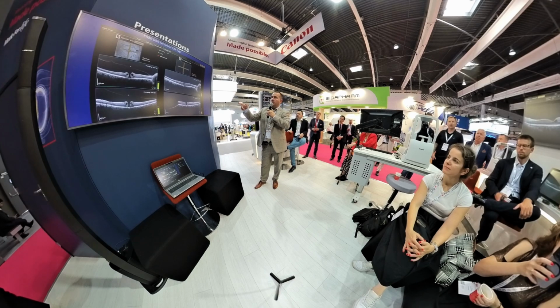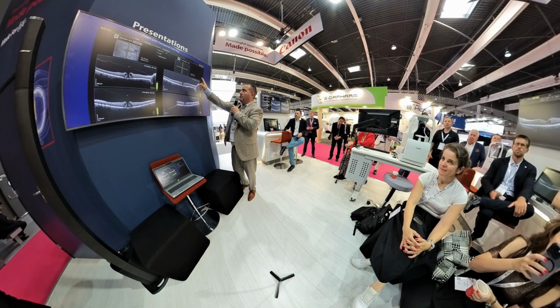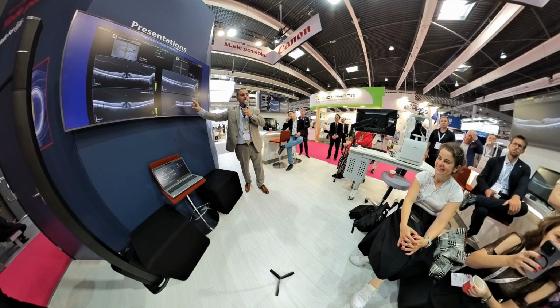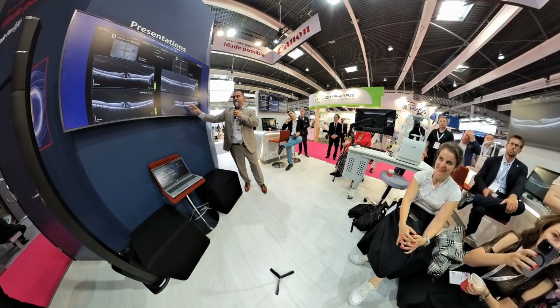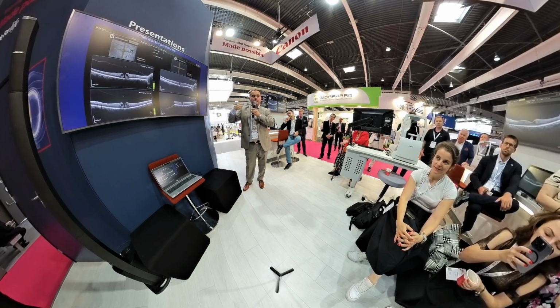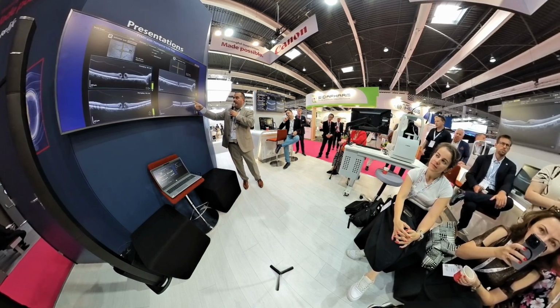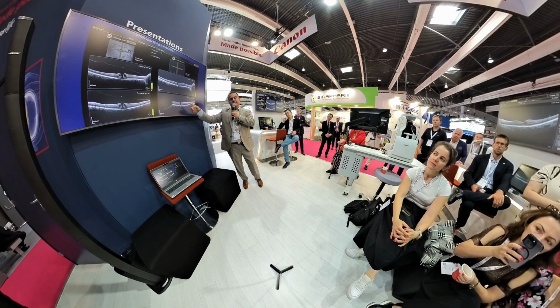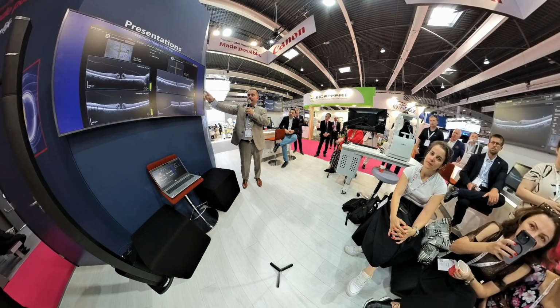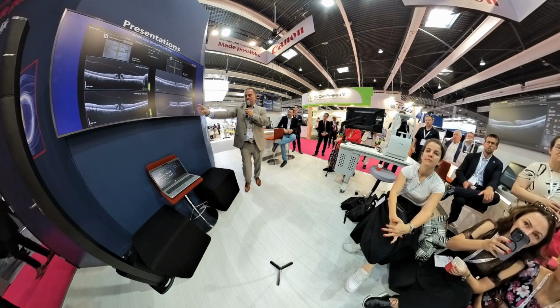This is a macular hole with a temporal ILM flap, and this is the view on the first post-operative day. What do you think? Is this a successful surgery or might it lead to a failure? The only answer is that we need to do a follow-up. From the literature we know that the ILM flap tends to progress slowly and close the macular hole slowly in some patients where the cystic changes show that it was a long-standing macular hole.